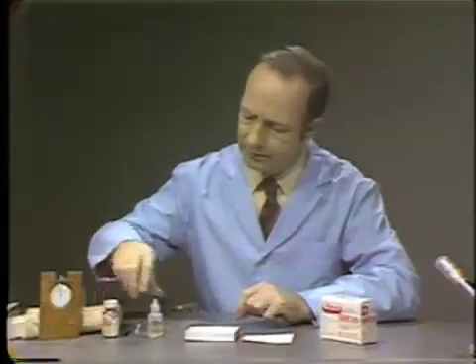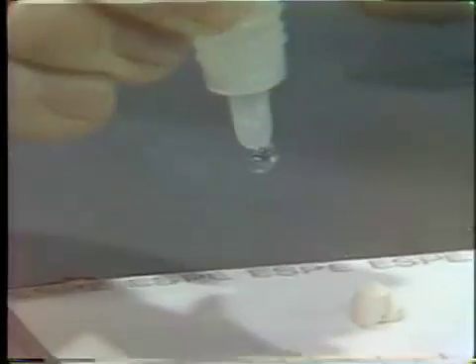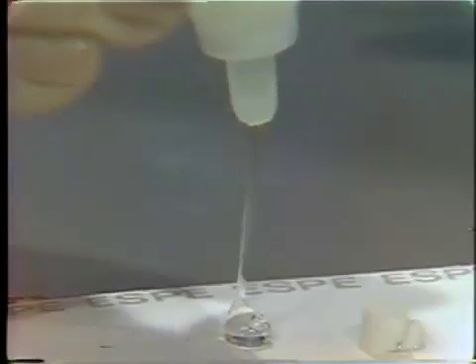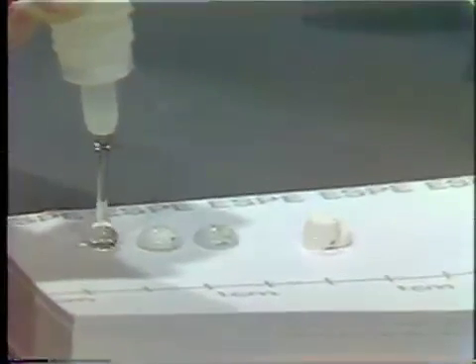The liquid is a rather viscous liquid, unlike the cement for the zinc phosphate material. The bottle should be held vertical and squeezed rather slowly, because this is a syrupy kind of consistency. Once the drop has about reached its maximum size, release the pressure. You can see this material strings out and is not particularly fluid — and that gives us three drops.